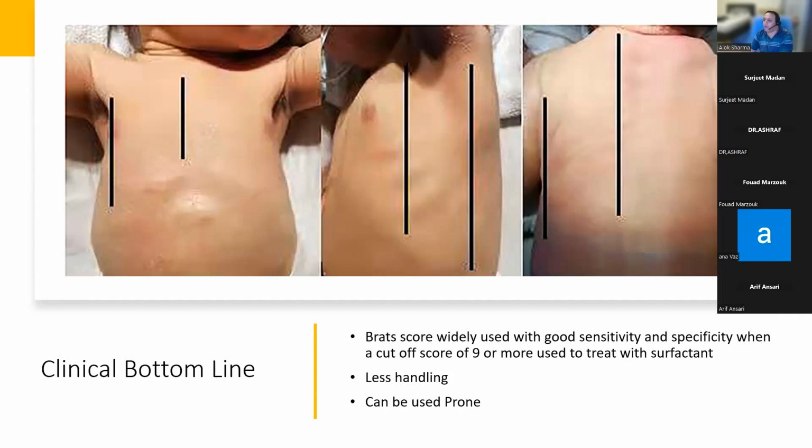So I wouldn't do it if my baby's back down in air and clinically better. Why should I? Yeah, true. Get what I'm saying? Yeah, unnecessary handling. But really, the reason for repeating it would be a baby who's not improving. If I find that my anterior lungs are well aerated, I'm going to do a comprehensive posterior scan. And in the posterior scan, if I see a massive consolidation with a fractal sign, then I know this baby's got a pneumonia.